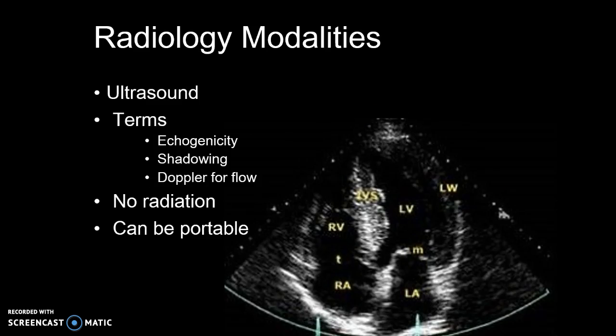Ultrasound imaging, or sonography, uses high-frequency sound to view inside the body. Because ultrasound images are captured in real time, they can also show movement of the body's internal organs as well as blood flowing through the blood vessels. Unlike x-ray imaging, there is no ionizing radiation exposure associated with ultrasound imaging. As many of us have seen in the ICU, ultrasounds can be portable and used in acute situations when looking at heart flow.